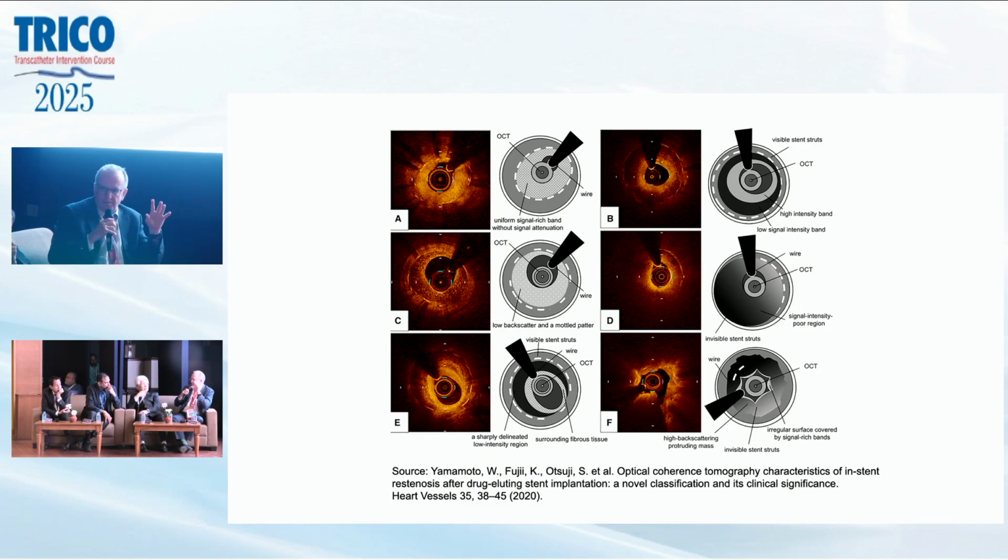But I do worry, that's why I asked this question earlier today. You see that little intimal dissection, and typically on an angiogram, you might not have even seen that. And so now we're going to be thinking, what am I seeing here? Now I've got to do this. I said I'm a little unsophisticated in comparison to many people in this room.